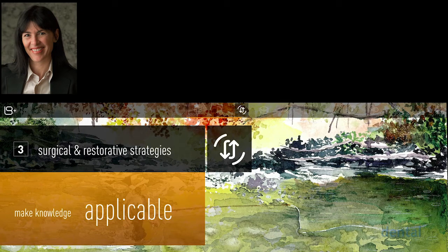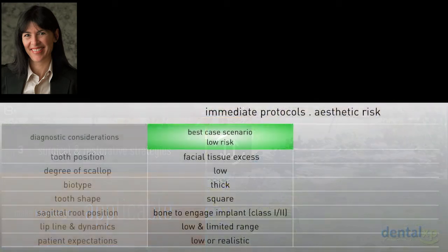Because this is no longer the generation where we extract, we let things heal. This is a generation where a lot of us are looking at immediacy of treatment, whether it's surgery or the restorative treatment. I happen to do a lot of immediate placement, and I do a lot of immediate restoration in my practice. I'm not going to tell you to do every case. Obviously, you have to pick and choose the right cases for it.